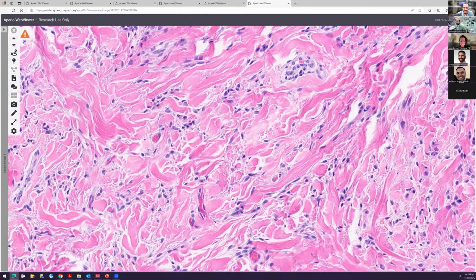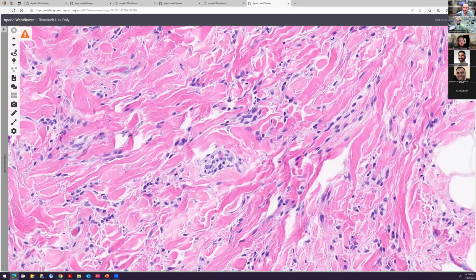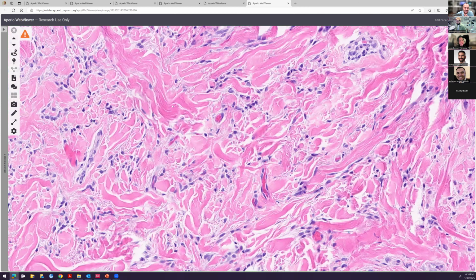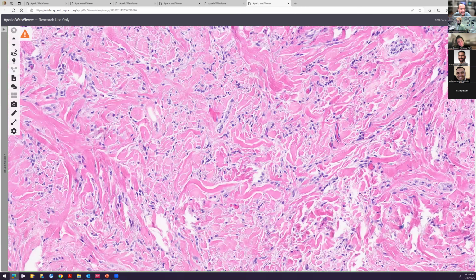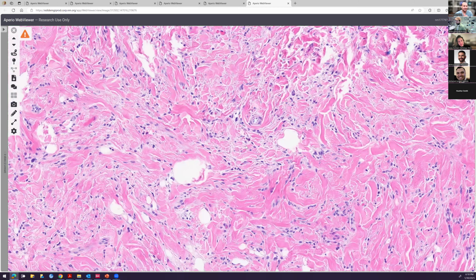It's very collagenous, kind of haphazard, but maybe there's some areas with a somewhat fascicular look, but it's much more collagenous in this one, fairly hyalinized, and the cells are pretty bland, right? Yeah, small, nondescript cells. Okay, yeah, exactly. What do you guys think? Any thoughts?